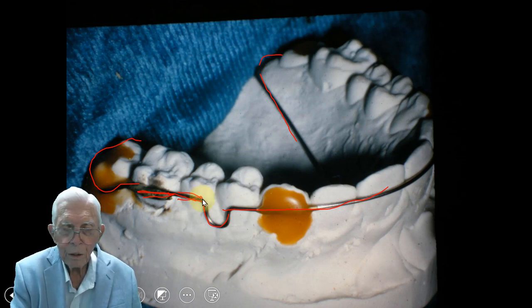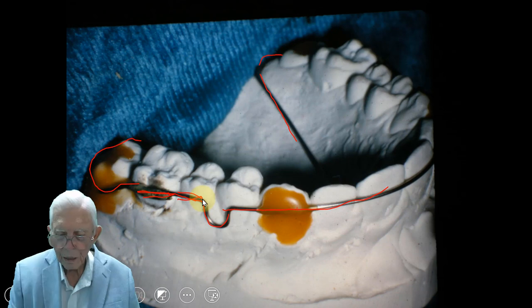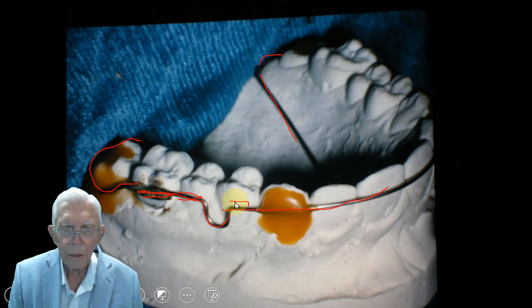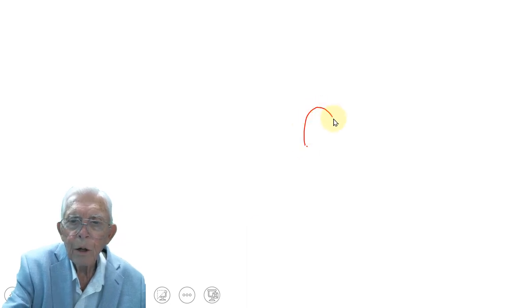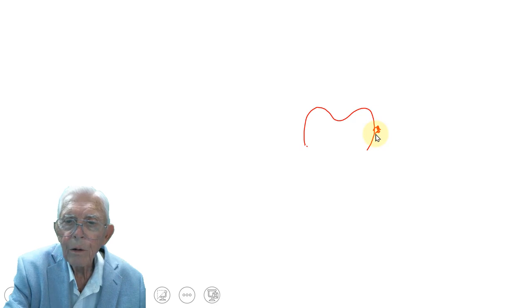Let me illustrate that a little bit better. You've got a tooth on the side of the retainer back here — this is a molar — and this wire is running all beside it right here. We just put a slight amount of good composite right on the tooth.